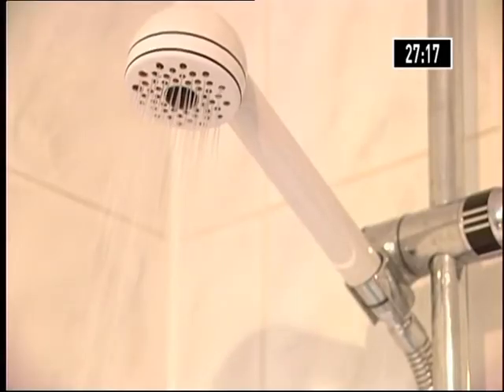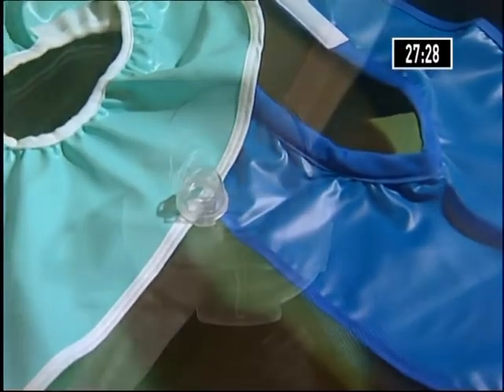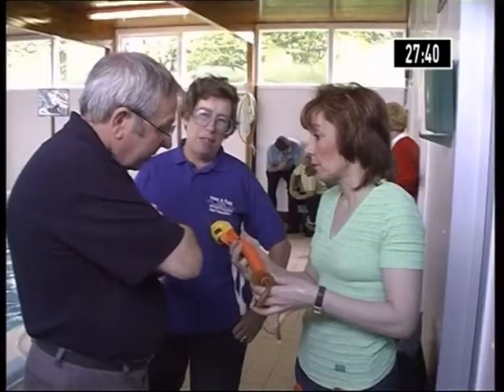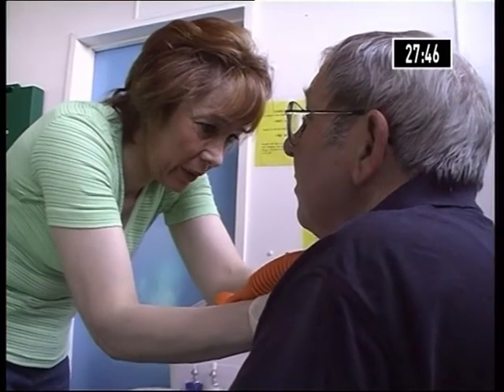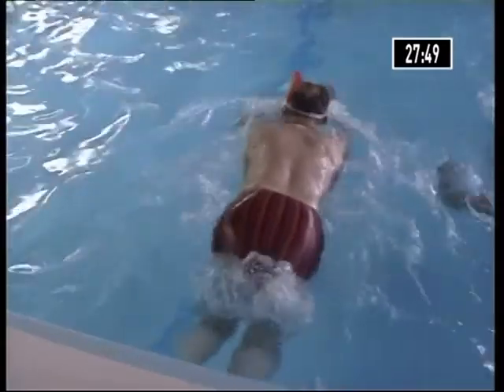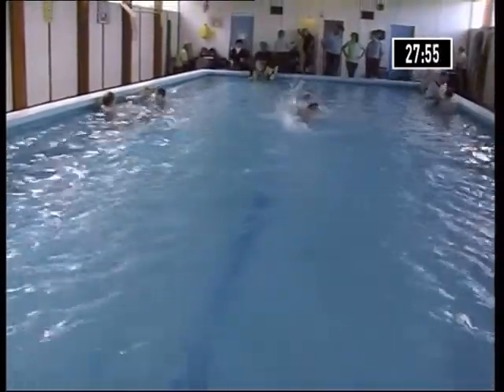Anyone who has had a laryngectomy will need to be careful with water, as the stoma leads straight to the lungs and water must be kept out. Various shower aids are available. Surprisingly, swimming remains a possibility, although only in very carefully controlled conditions — a few laryngectomy clubs around the country provide the right environment. Given the right conditions, swimming can be a highly beneficial form of exercise, so if the local club organises swimming sessions, you may want to suggest they are worth attending.